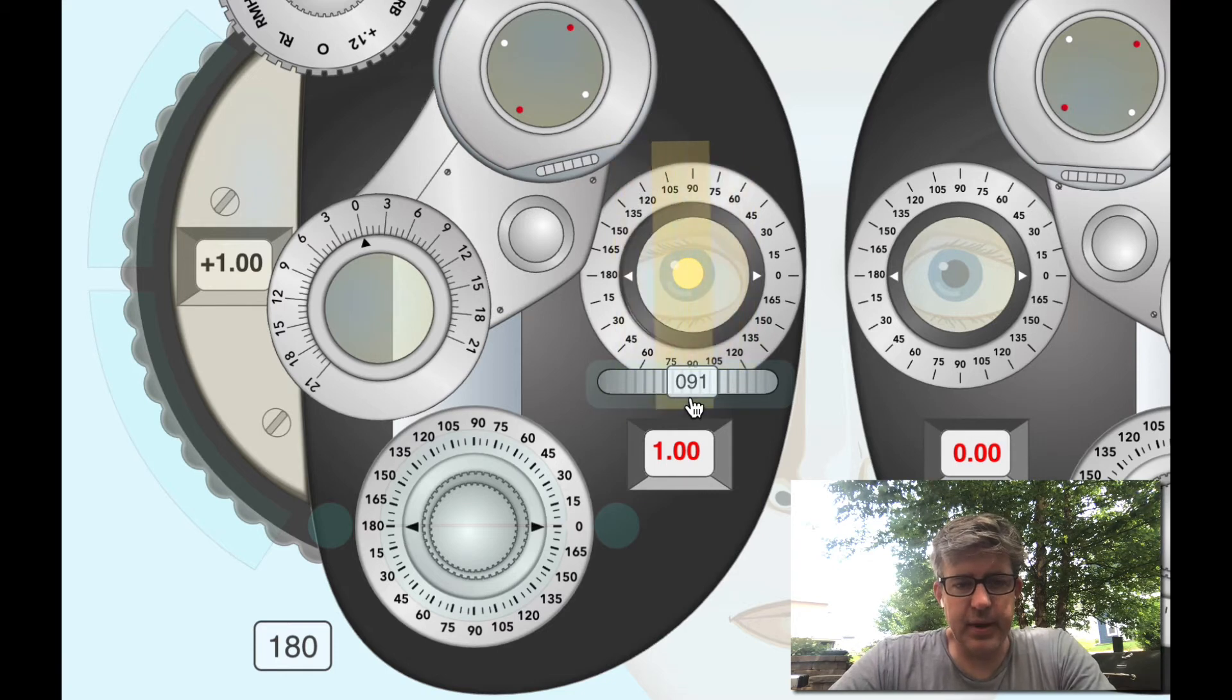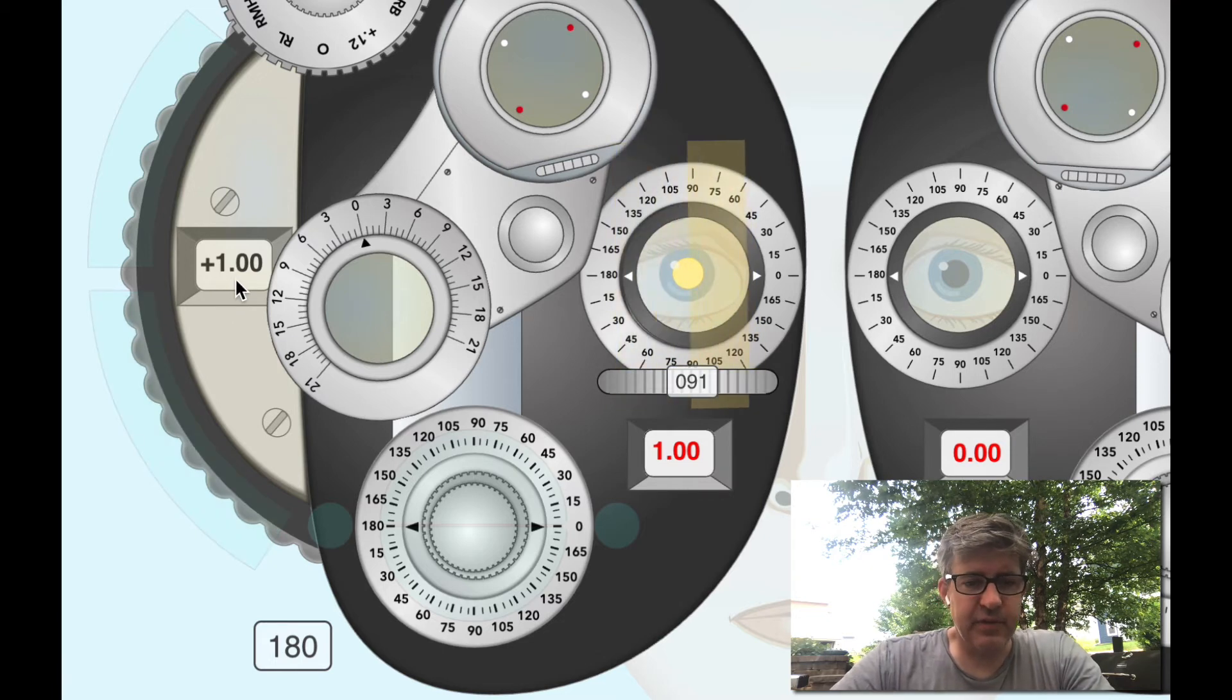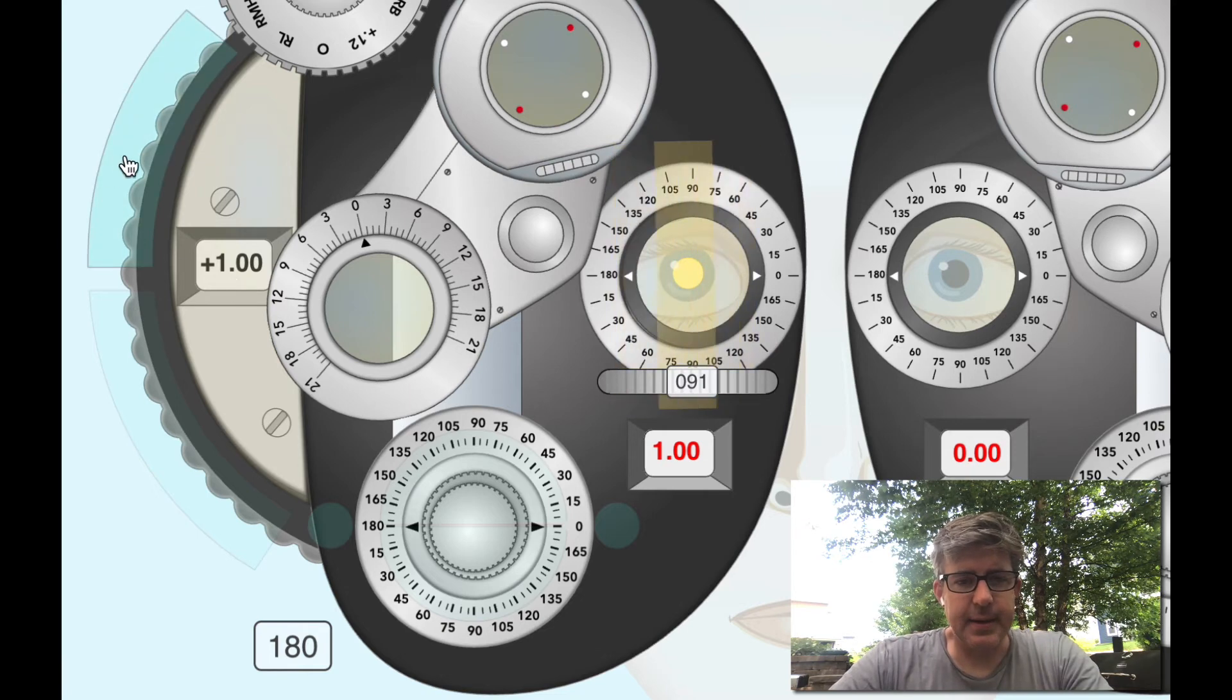I've neutralized this, but when I see neutral that means that this patient is now focusing at the distance of my retinoscope, which is great. But when I prescribe glasses they're probably going to want to see far away, so I need to deal with my working distance. I'm using a 150, so that means I have to add minus 150 to my result. I could add that to one, one plus minus 150 is minus 50. But usually what I like to do is just start clicking on the sphere wheel and go up six steps, because six times a quarter point two five, six times point two five is 150.